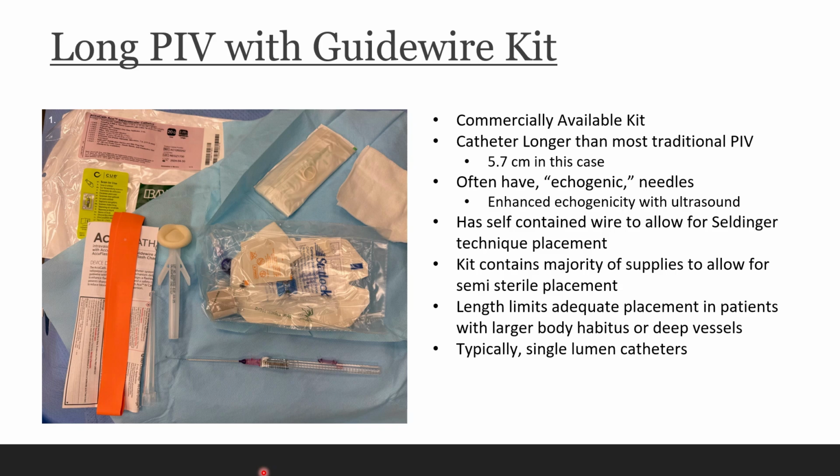Got everything to do sterile or semi-sterile technique except for your gloves, plus or minus a gown. You can do that if you like. Got everything in here to help secure. Still need some end cap adapters and a flush. That catheter is only a single lumen. I think I've seen some products with maybe multi, but especially with midlines and PICCs, you can end up with multiple lumens, so you can infuse more than one thing at a time.